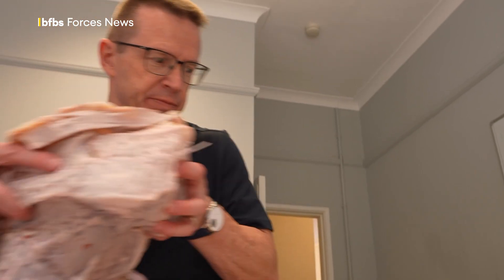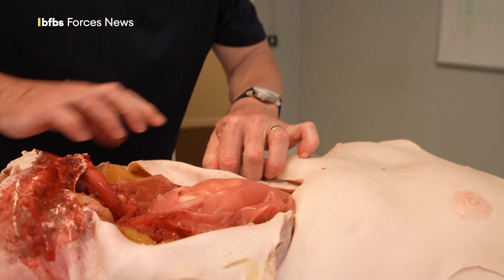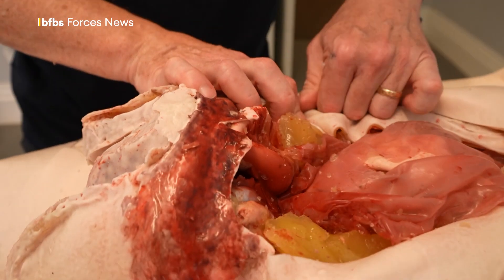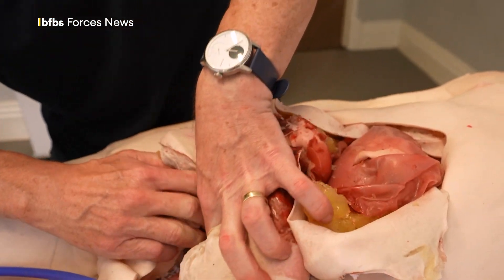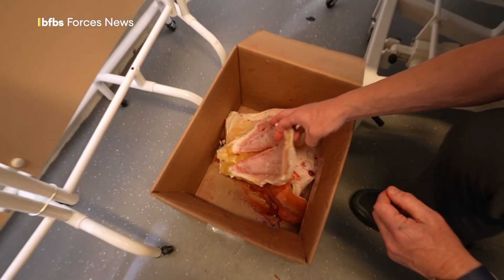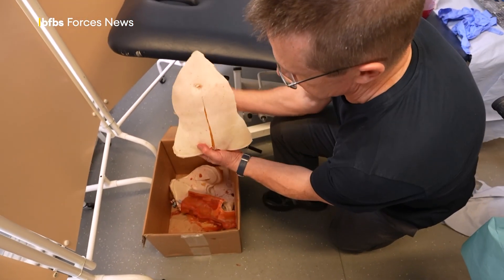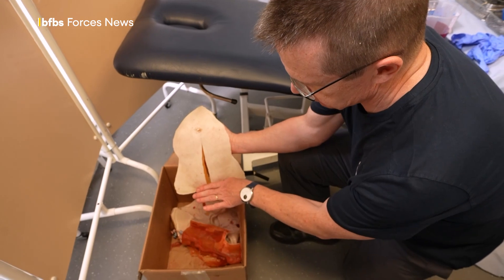The anatomical accuracy of SAM's insides was a fine balance. It needed to be realistic enough to be useful, but some simplification was required so his parts are reproducible and not too expensive. This is one of the real advantages of SAM. Until now, lifelike surgical mannequins have been made, but once they've been cut into, they're not very reusable. SAM, on the other hand, can be cut open and then repaired over and over again.